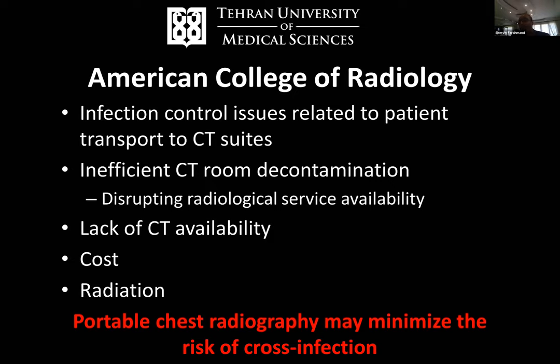The decontamination process for CT scan units is inefficient and time consuming. Because of that, during a pandemic or epidemic like our situation, these time-consuming decontamination processes for suites may disrupt radiologic service availability.